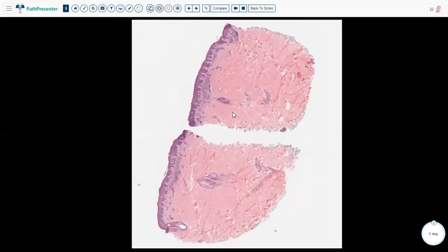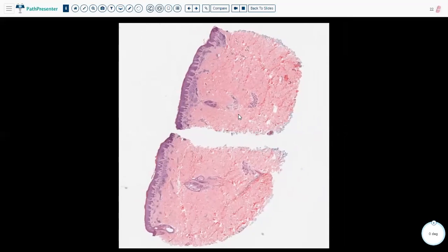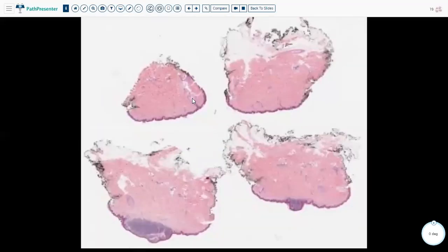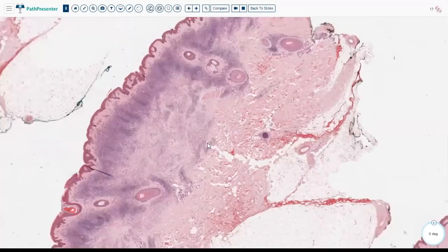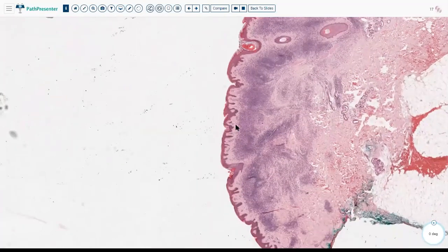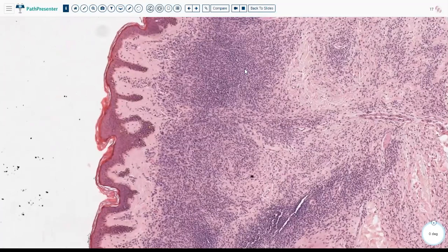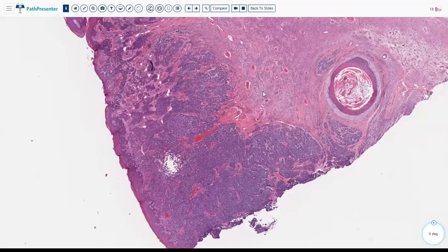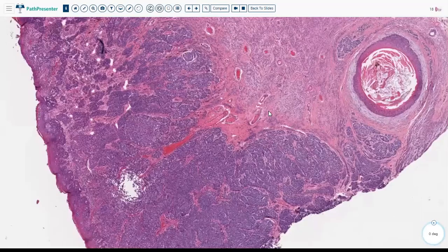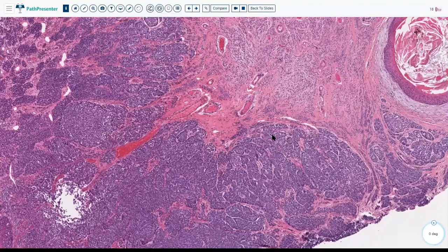Before the halo nevus, you said something about the melanocytes being sharply demarcated. Was that a feature of congenital nevus or something else? What we were talking about in the congenital nevus is that when you find large nodules in the congenital nevus, if it fades away with the rest of the lesion, this is a reassuring feature. When you find a large nodule that you can sharply demarcate from the rest of the lesion, that's a feature that might mean that this patient developed a melanoma within their nevus. So is that what you were asking about? Yeah. Okay. Thank you.